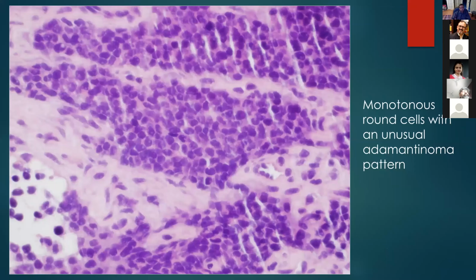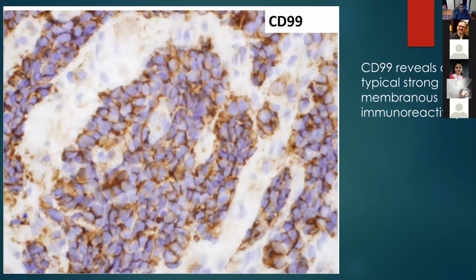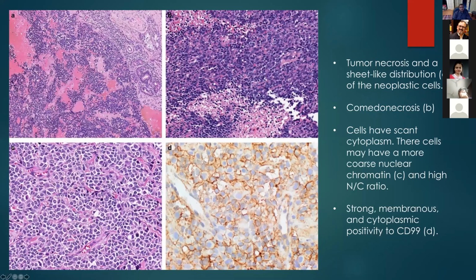You will throw your same panel that I talked about at first. Okay, you get CD56 positive. Here is CD99, which is the diagnostic stain, CD99. Once you get some neuroendocrine marker positive, CD99 is strongly positive. Here's another example. Here is the previous one. Look at how it misses the nuclei. Then look at this, positive. You get necrosis, small round, atypical round, diffuse round. You can get a nested pattern. You can get an alveolar pattern.